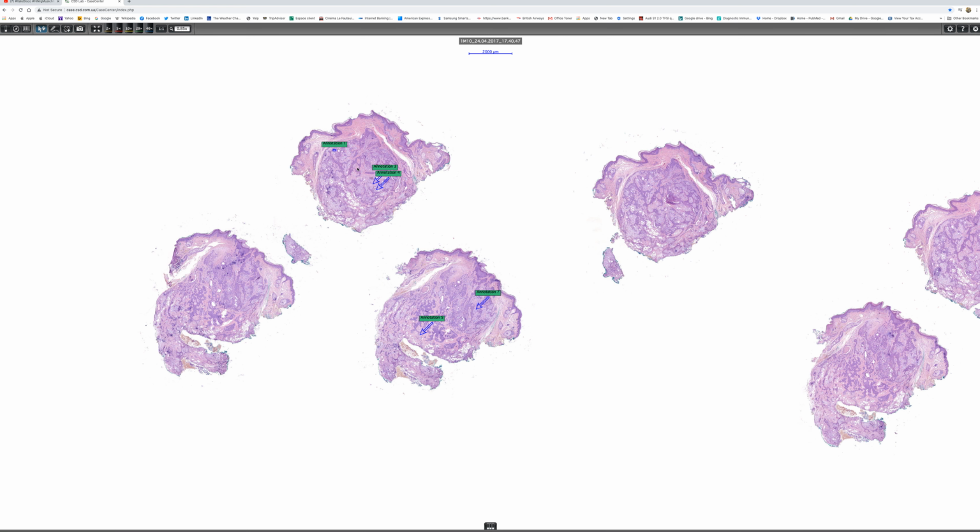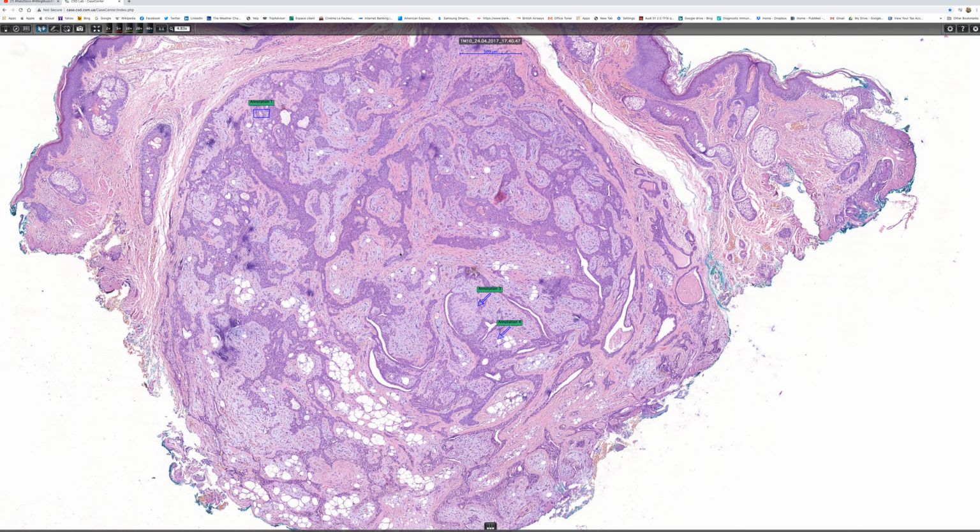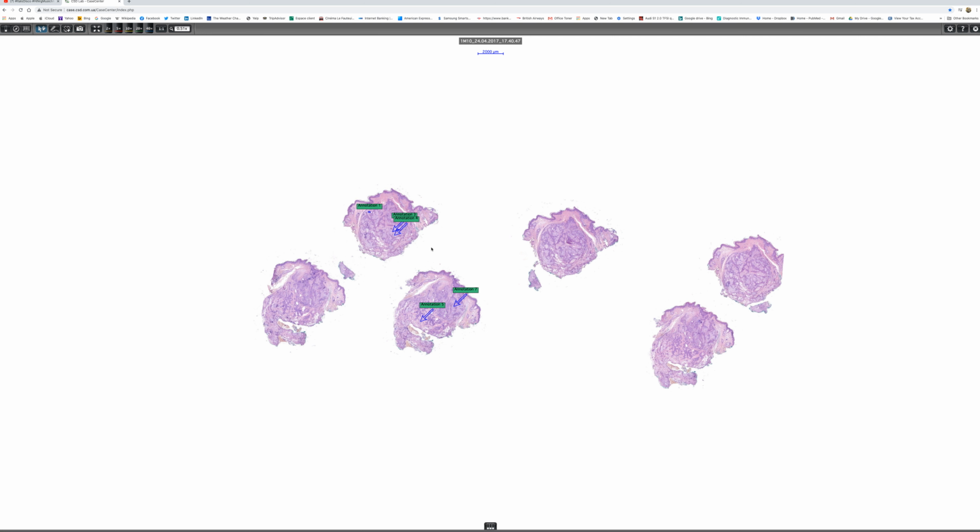But the only occasions that I've ever diagnosed a malignant chondroid syringoma have either been in a patient in which there is pre-existent chondroid syringoma associated with a carcinomatous element, or a recurrent tumor in which the original biopsy was clearly chondroid syringoma, but the recurrence is malignant. And it's worth noting that sometimes malignant chondroid syringoma can have a carcinosarcomatous, or if you like, a metaplastic component with malignant chondroid and even malignant osteoid.